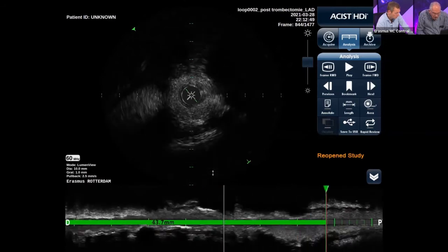Yeah, a length of, it's written in the middle here in the green, 43.7 or 44 millimeter stent. Yep. Then we have a big caliber change between the proximal and distal landing zone, about 2.5. Yep. So this is a STEMI case with a vessel that was still a little bit spastic.